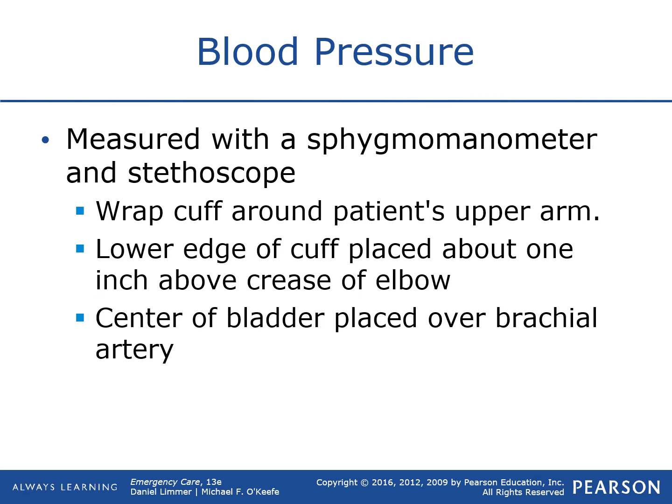So there's instructions here on how to take a blood pressure. This is something that's a hands-on application. So if you're struggling with this, feel free to see me in person and we will go over how to actually take a blood pressure. General rules: you want to put the blood pressure cuff on, make sure it's nice and tight. You want the center of the bladder placed over the brachial artery. That's what that line is for.